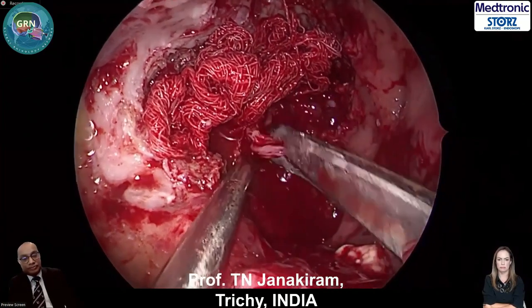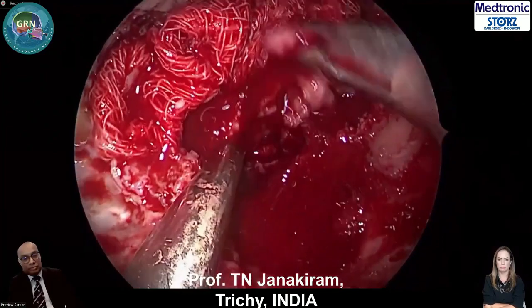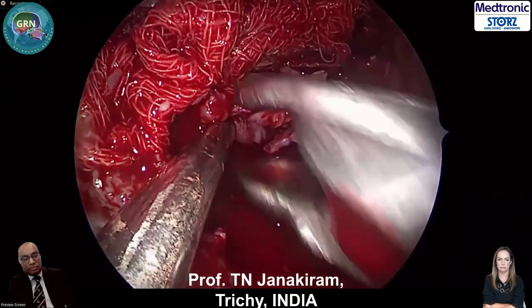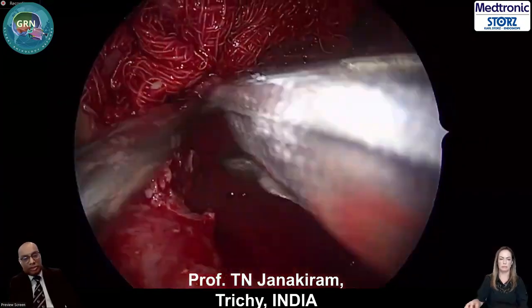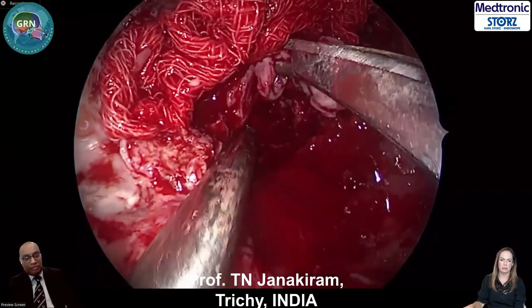This is the advantage of four-handed surgery. See how my suction is working along with my forceps, and my scope is not getting fogged. I can see the tumor coming out beautifully and brilliantly from all the crevices there. Can you all appreciate that, please? Yes. Yeah, you can see it's peeling off nicely.